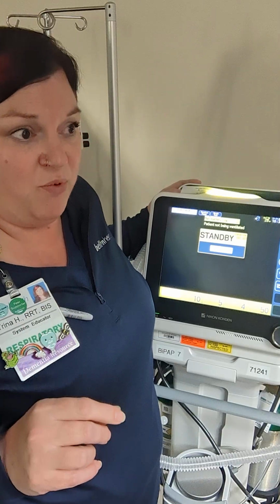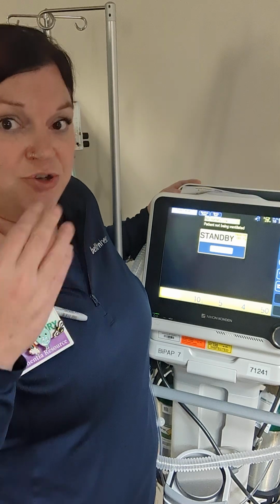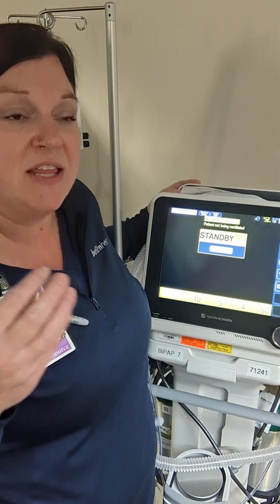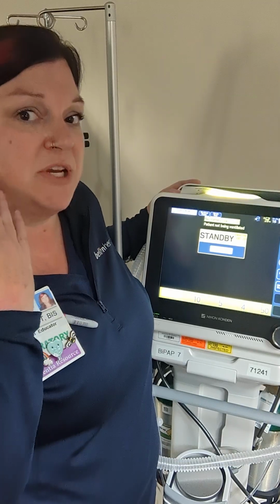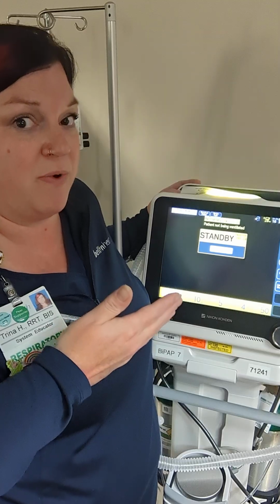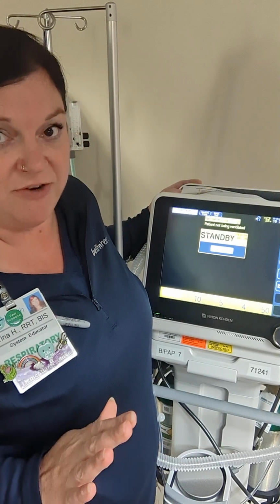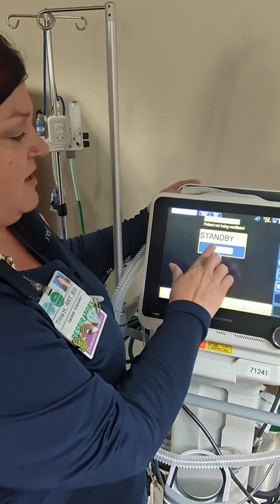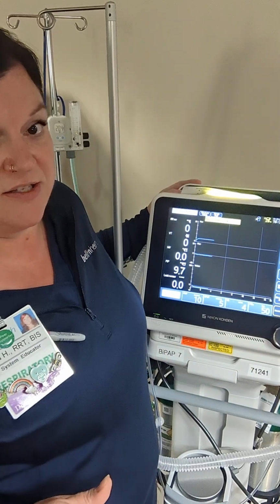The one thing I will point out is if you're going to give your patient pills and they're drinking water, make sure that after they take that last sip you have them cough or clear their throat, just to make sure there's nothing in their mouth that, with the addition of positive pressure, could get pushed into their lungs. So we just want to be mindful of that. But when you're ready, you can put the mask back on, resume ventilation, and it goes back to those settings that we already had.